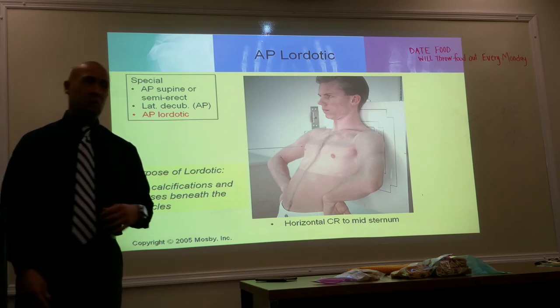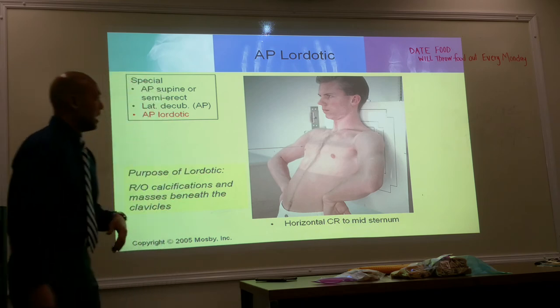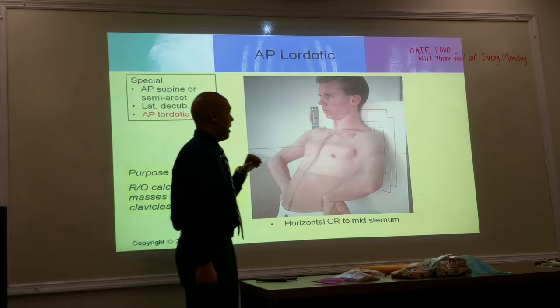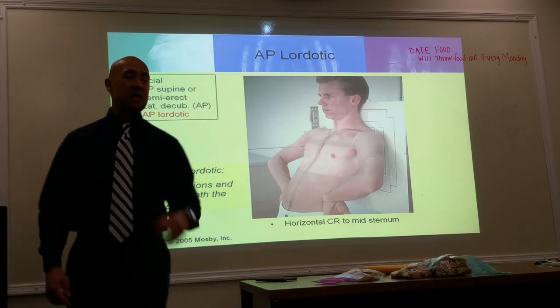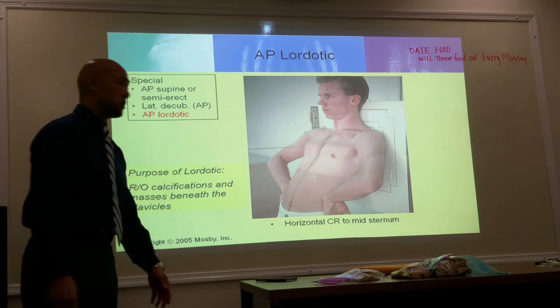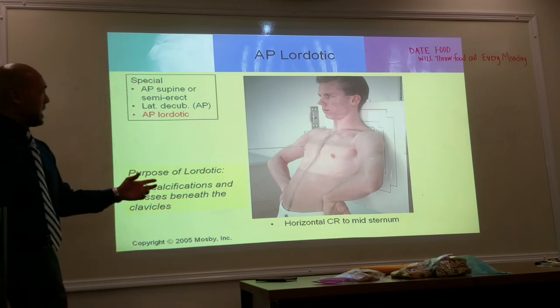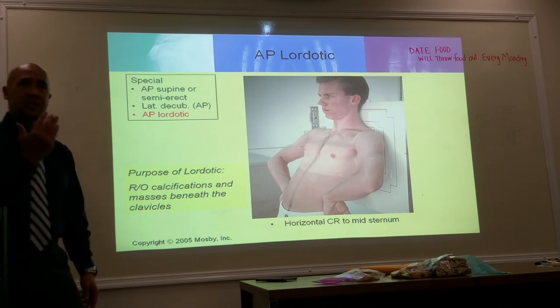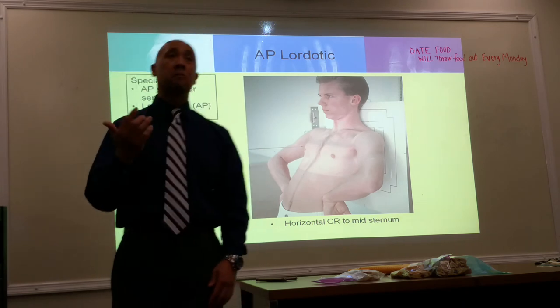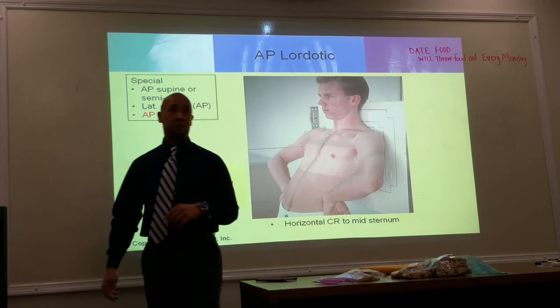All right, lordotic. The purpose of the lordotic is to rule out any calcifications and masses beneath the clavicles. By having them lean back, it puts the clavicles up, because we want to look at the apices of the lungs to evaluate for any type of masses or calcifications. More specifically, we can use this for tuberculosis, where they like to congregate at the apices of the lungs. So here, this is AP. This is the exception. Remember in our AP supine and semi-erect, the central ray was perpendicular to the sternum? Here we don't want that. Here we want the central ray perpendicular to the image receptor.